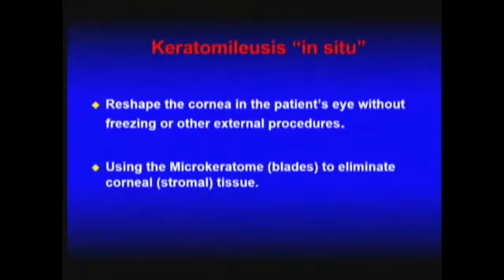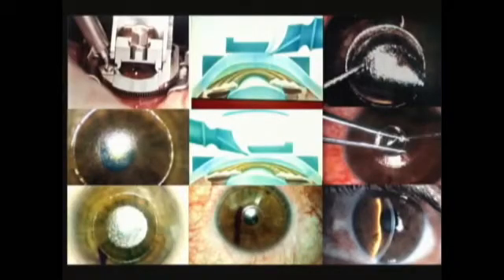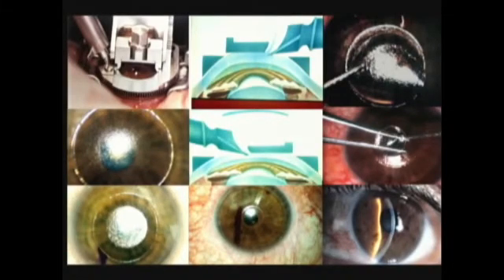The keratomileusis in situ was designed by Luis Antonio Ruiz, one of the disciples of Dr. Barraquer, and he reshaped the cornea in situ. So he didn't need to remove it. Using just the microkeratome, the blades, he passed the microkeratome twice, the first one to cut the disc and the second for the lenticule. We used, at the beginning, manual microkeratomes, then automatic microkeratomes.